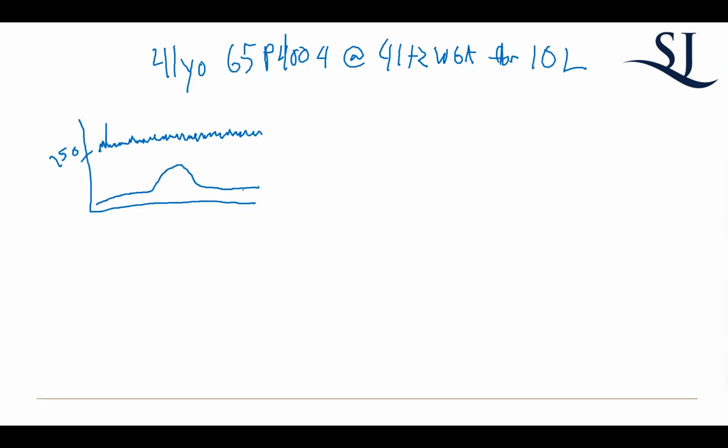What do we think? Oh, and I didn't give you mom's pulse. Sorry. What do we think about this? It's non-variable, right? No, I was saying the heart rate is not variable. It seems almost linear to me, except maybe the first vertical line over there. I'm not sure if I'm seeing correctly.